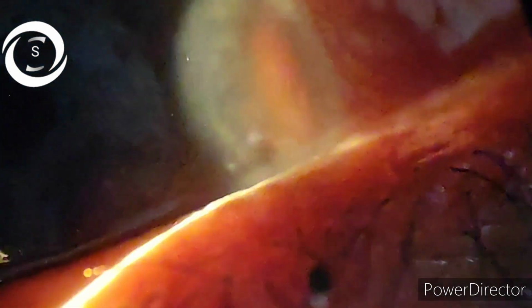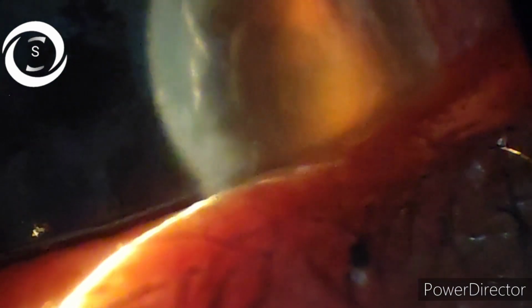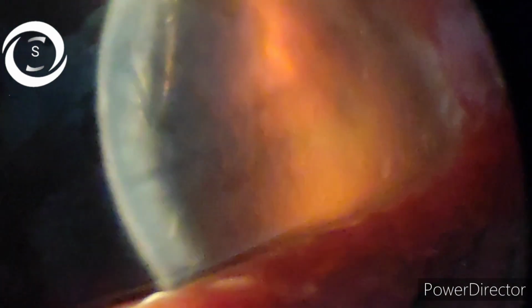Then, if it is folded, it is unfolded, and then intracameral tamponade with an air bubble or non-expansile concentrations of SF6 or C3F8 is injected to oppose the Descemet membrane to the corneal stroma.